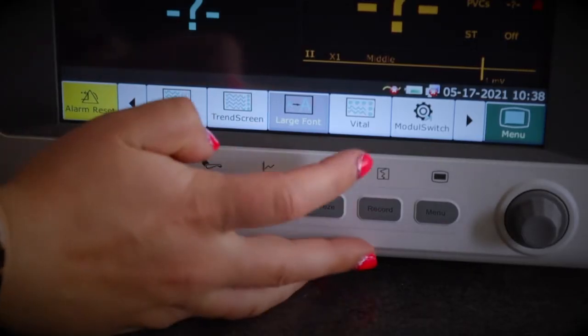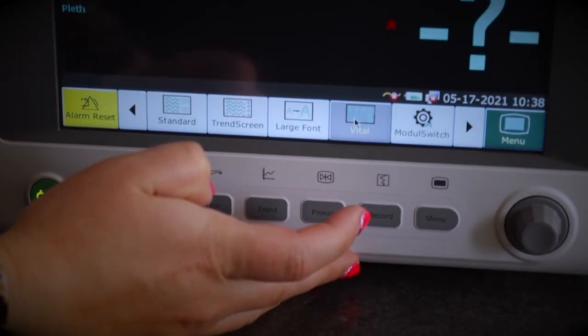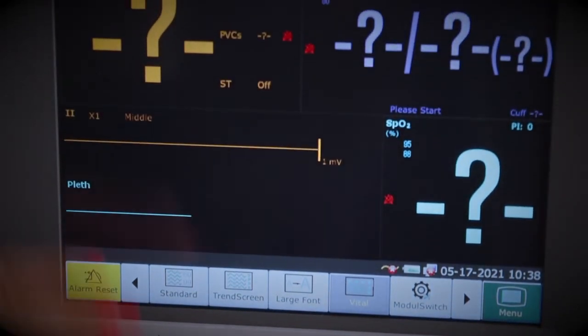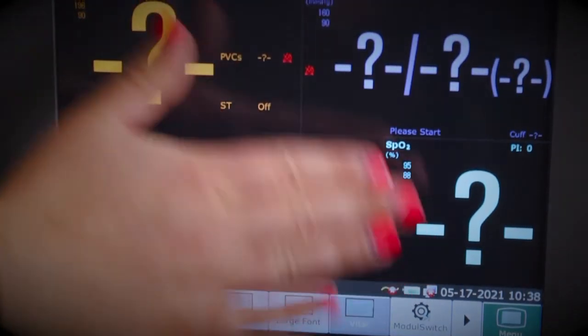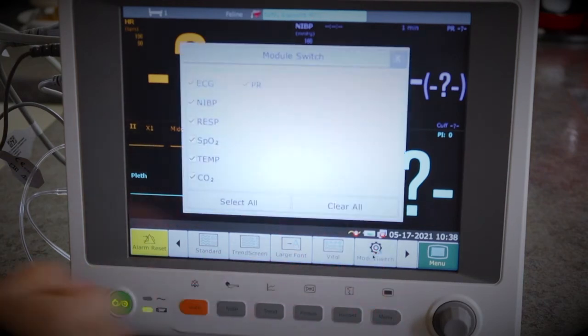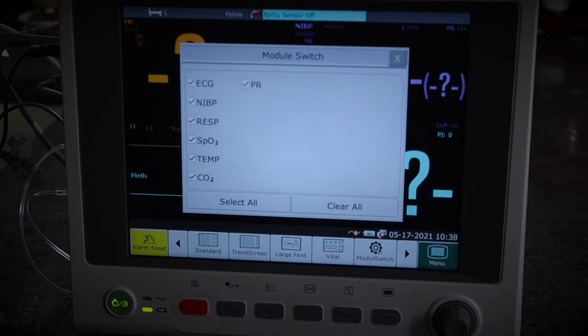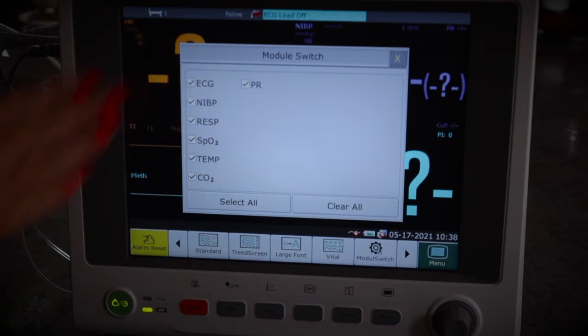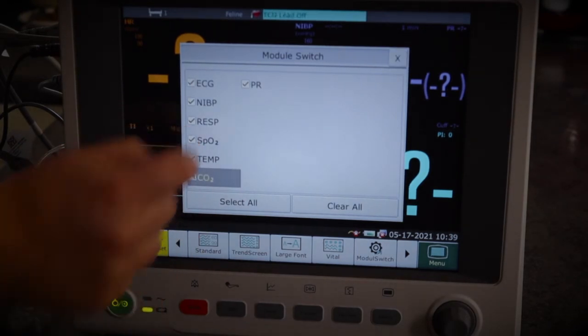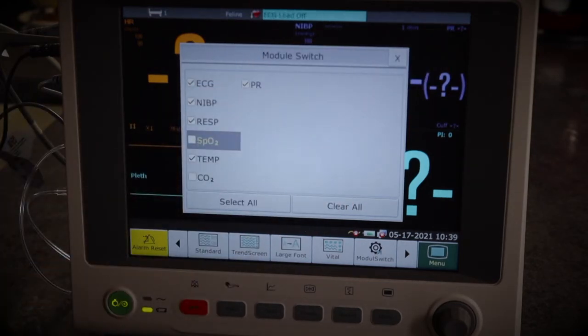We have vital — clicking it brings up just the vitals, not every single parameter. In the case of this machine, it shows heart rate, SpO2, and non-invasive blood pressure. Next along is module switch. Clicking it lets you tailor the standard screen to what you want to see. If you have everything ticked it shows everything, but if you're not using SpO2 or the capnograph that day, you can untick those and set your standard screen exactly how you want it.